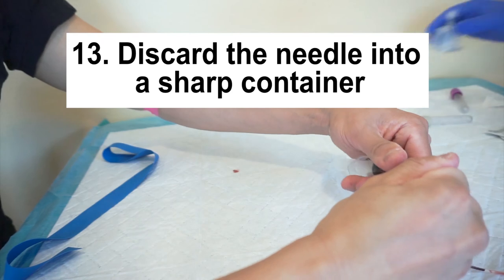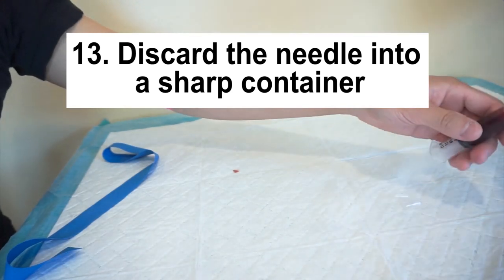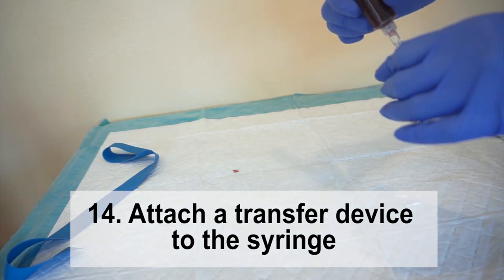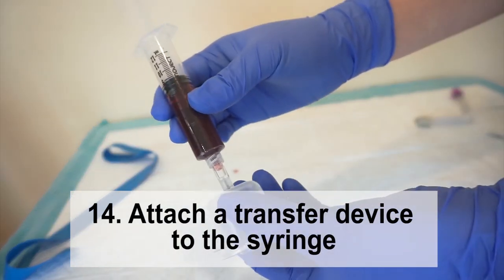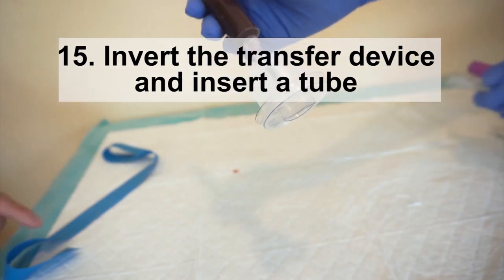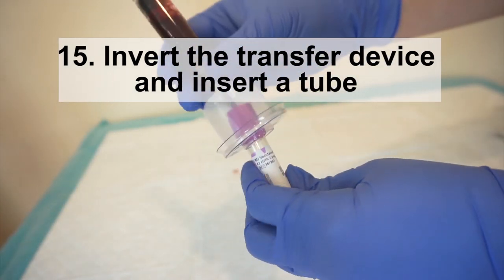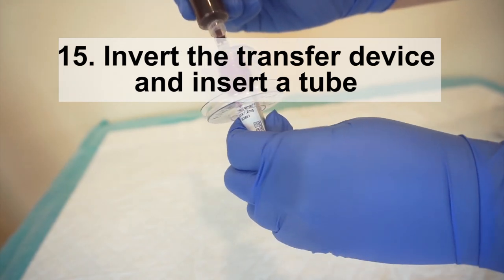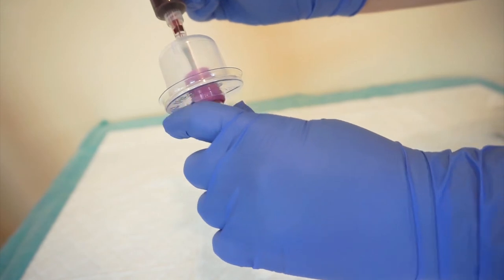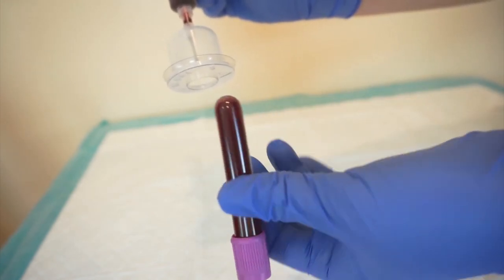Thirteen, carefully unscrew the needle part and dispose of it into the sharps container. Fourteen, get the transfer device and attach it to the syringe. Fifteen, turn the transfer device upside down and insert the tube from the bottom and let the vacuum do the work. Once the tube is filled up, continue on to the next tube. Once it's all done, discard the syringe and the transfer device into the sharps container.